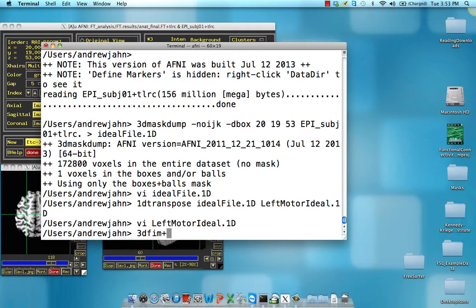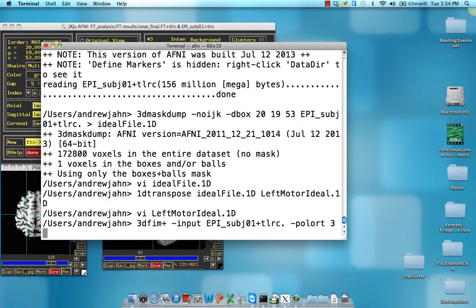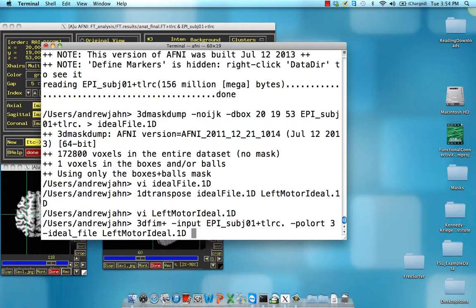This uses a command called 3dfim plus, and the input is going to be that epi subject 01 image. Pollort, let's get rid of everything, that would be cubic. And for the idealfile, we're going to use that recently generated leftMotorIdeal.1d file.